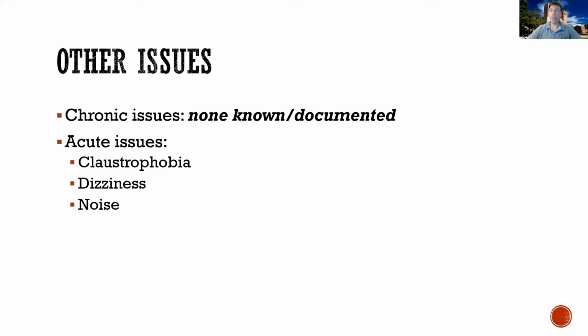Some people do experience dizziness. I myself, in fact, experience dizziness almost every single time I enter an MRI machine. And this is most likely associated with the transition as somebody is placed on the bed of the MRI and then moved inside of the MRI, you're rapidly traversing a changing magnetic field. So that might induce dizziness, perhaps acting on the otoliths in the ear or via other mechanisms.